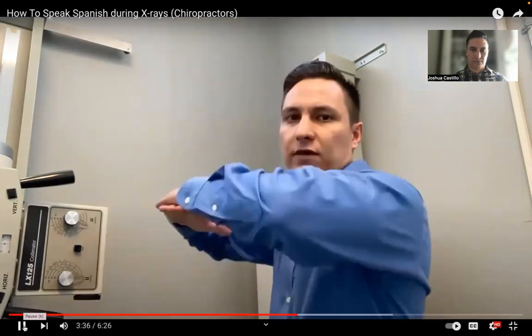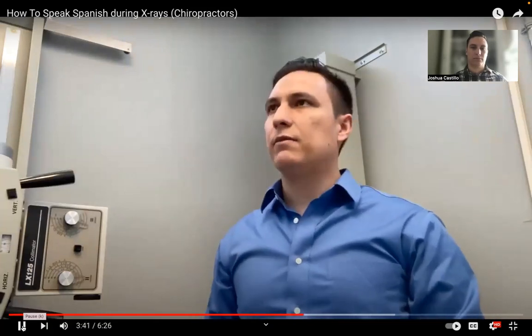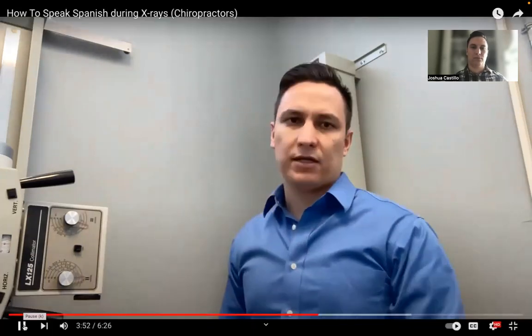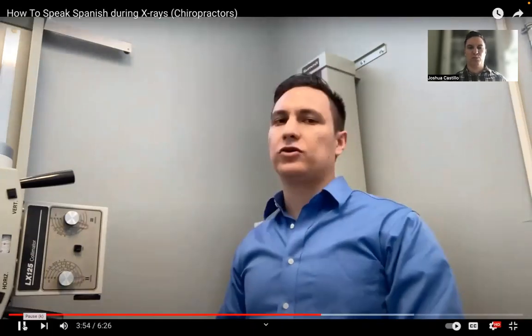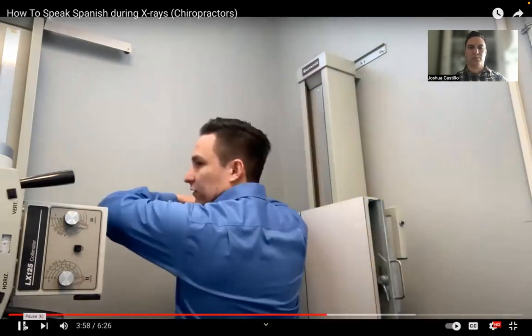Depending on if you do this or this to get them out of the view, you kind of have to play that by ear because some patients are in a lot of discomfort. So before you have that command of hombros así, you might have to wait if they're in pain. If it's just a low back condition and they don't have anything going on in the neck or shoulders, you'll be okay just having them sit like this for a bit.